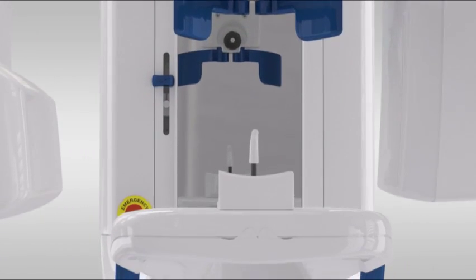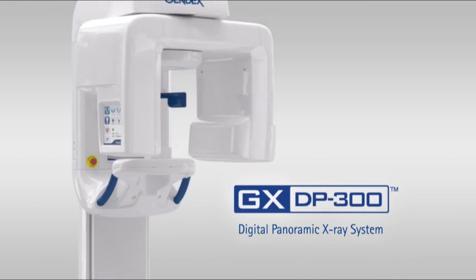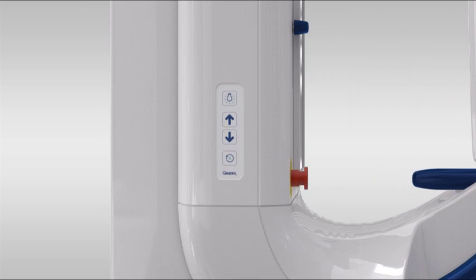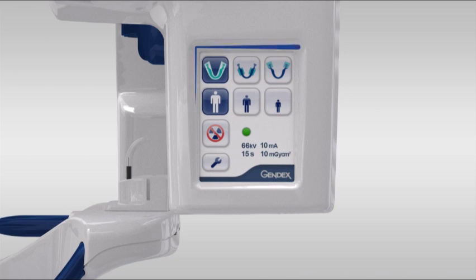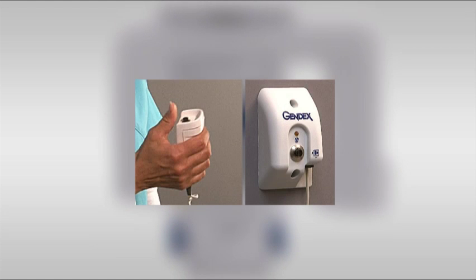Welcome to the GXDP300 training video on positioning for acquiring optimum TMJ images. It's important to familiarize yourself with the various parts of the system. Included are the rotating unit, column controls, touchscreen, easy position items such as the bite rod with attached bite guide, chin rest, head supports, hand grips, and positioning lasers. Finally, the exposure trigger, which may be either a handheld device or wall unit.